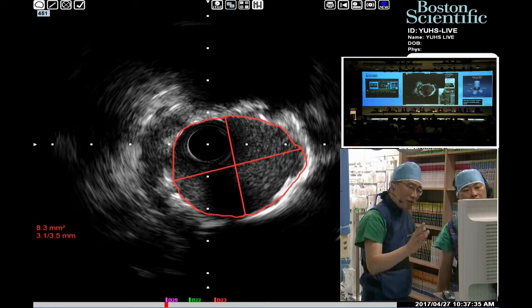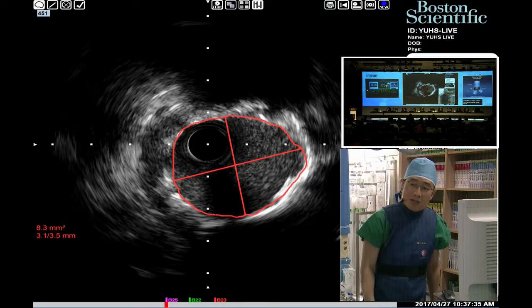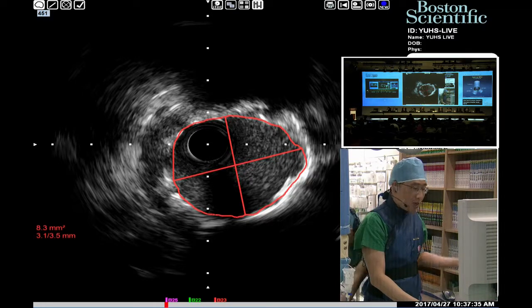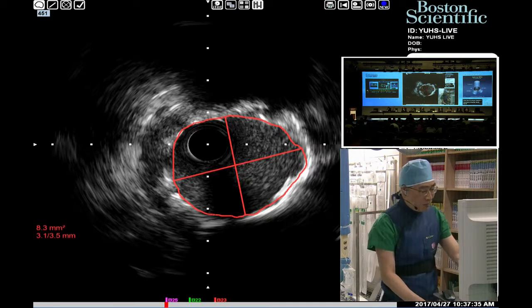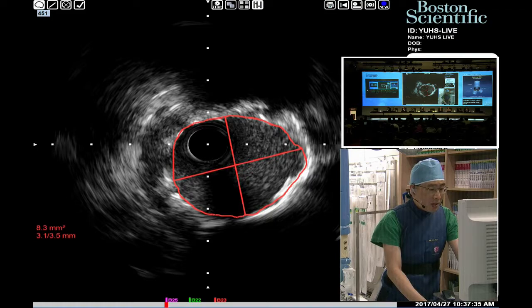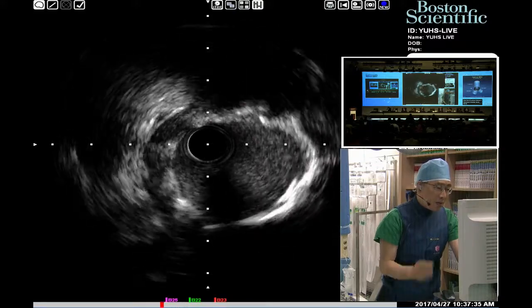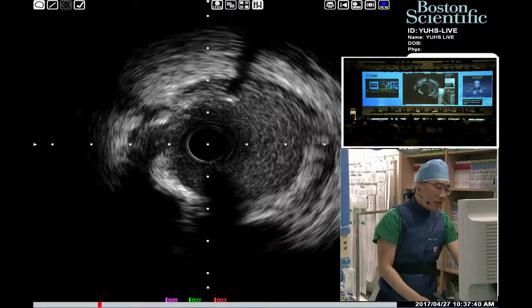So it's quite similar, 8.3, but it is acceptable. For the minimal stent area, as you know, the previous report predicts future clinical outcome, future events. The LAD ostium is 6, the polygon of confluence area is 7, and distal left main usually.